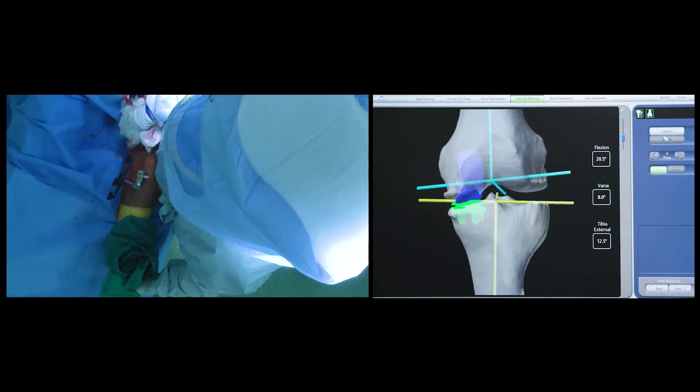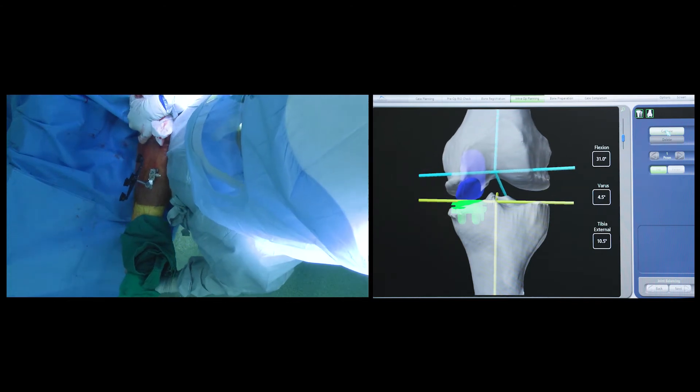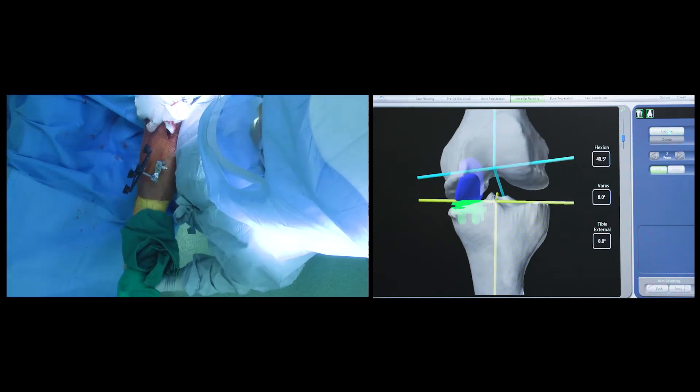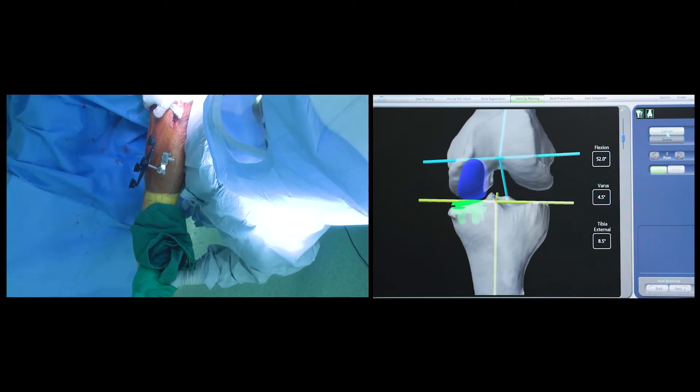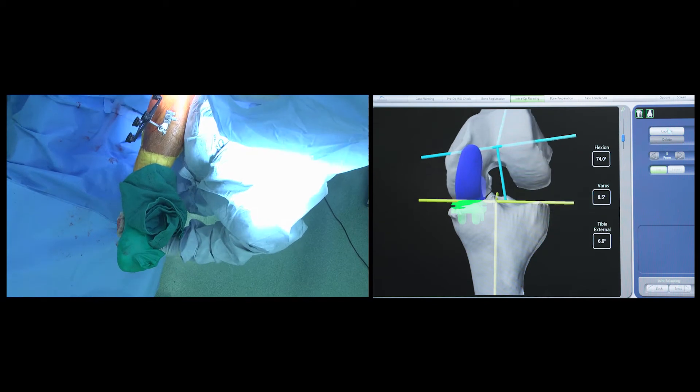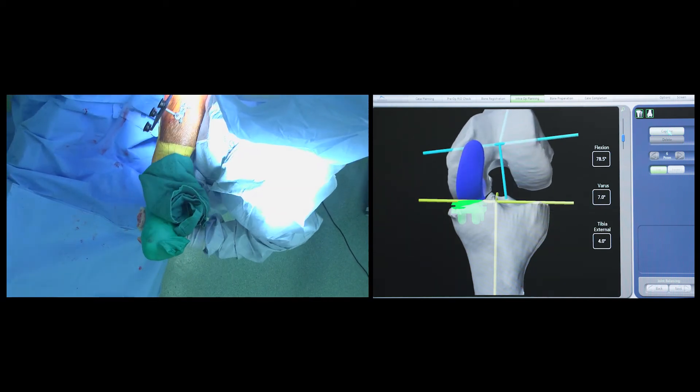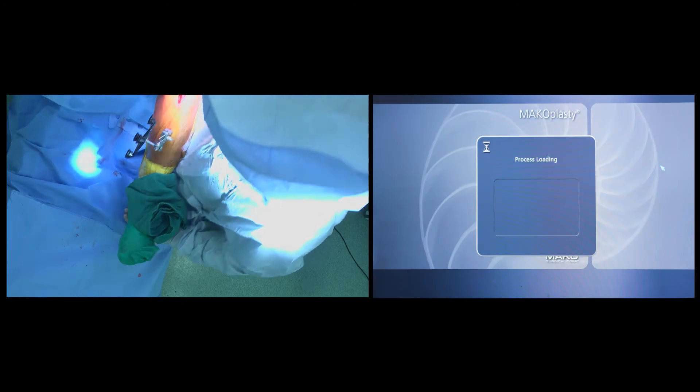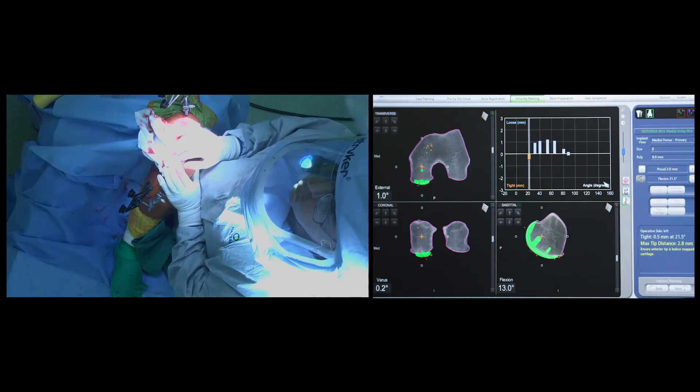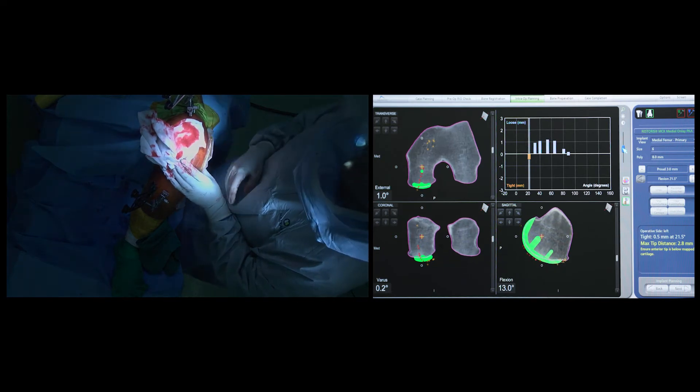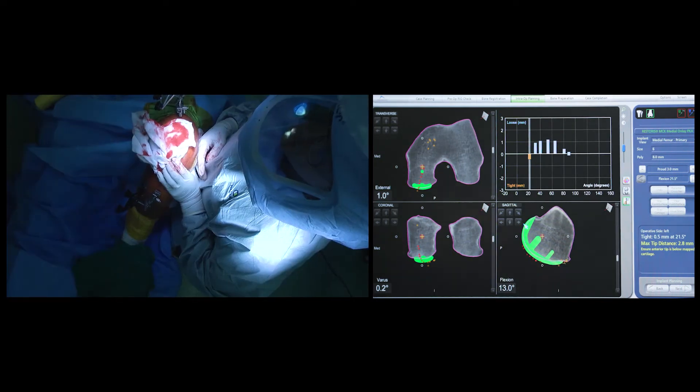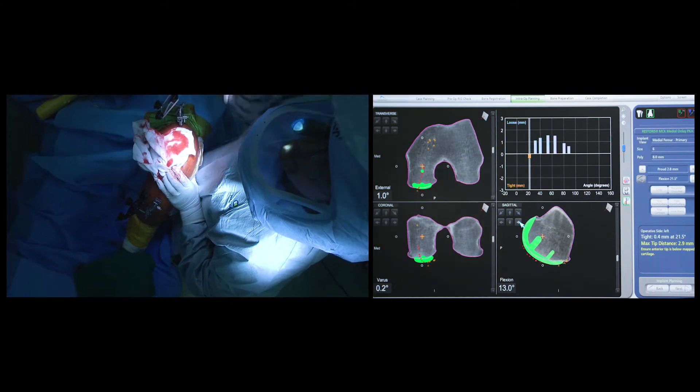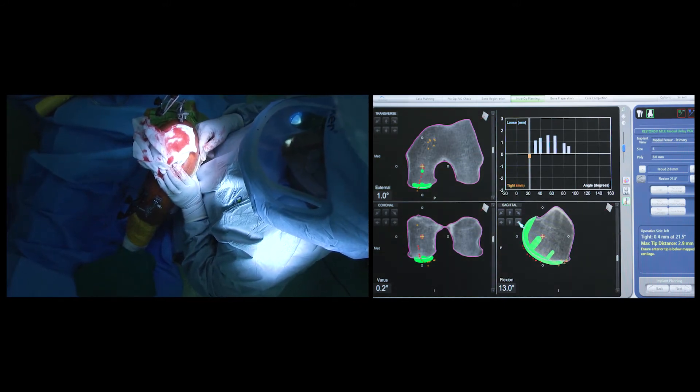After some initial fine-tuning, the tension of the medial ligament and the opening of the medial joint line is tested once again. The bar graph generated is further scrutinized to ensure an even and uniform opening of the medial joint space between 0 to 90 degrees of flexion.